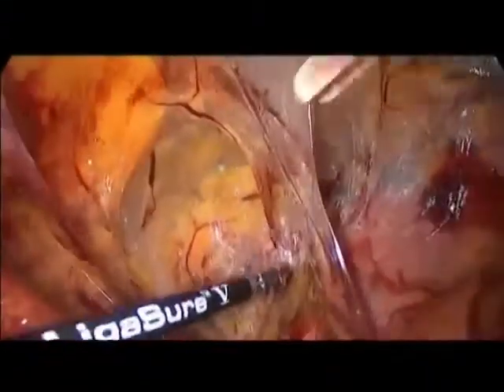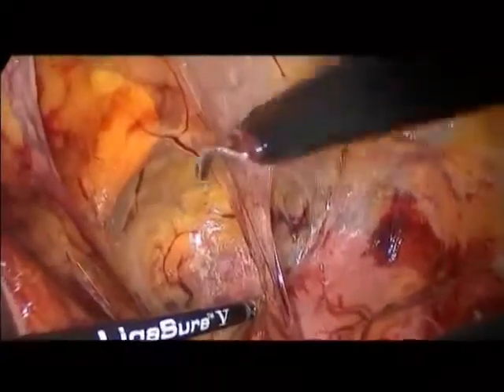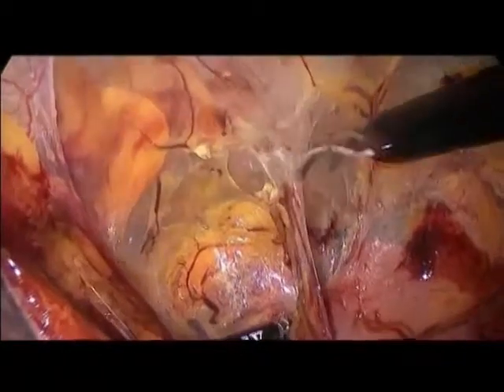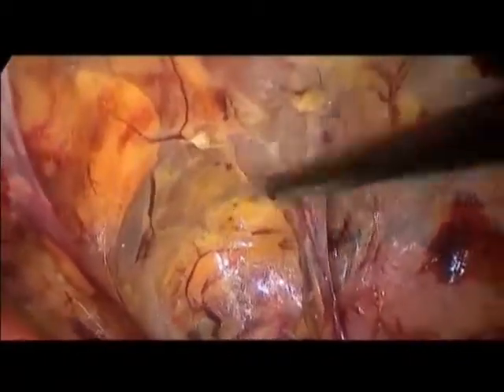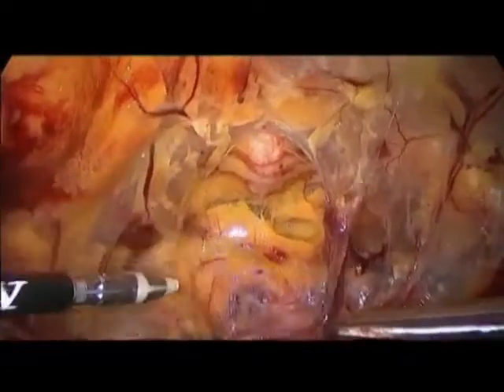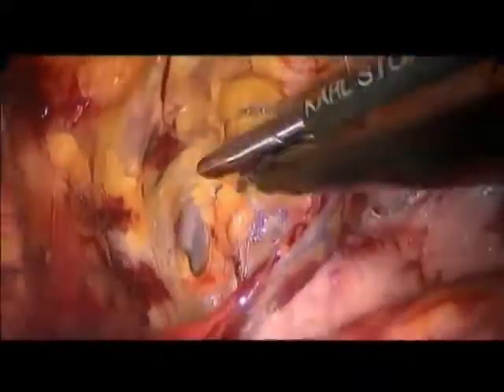You see how short this approach can be in terms of time allotted to this maneuver, and this compares, I think, favorably with the time allotted to the development of the preperitoneal space from the very beginning of the procedure.